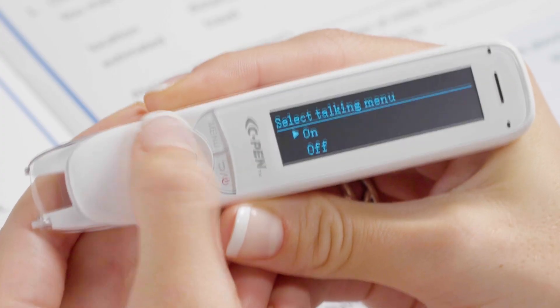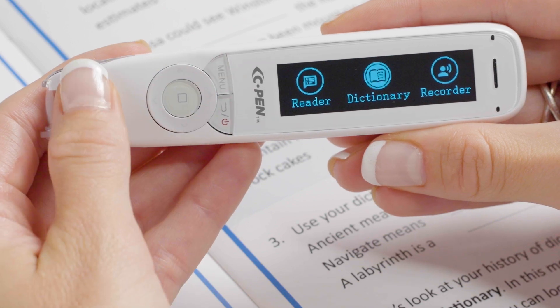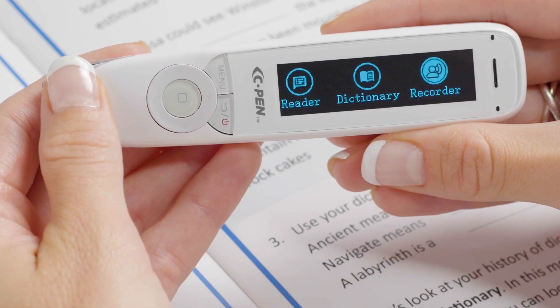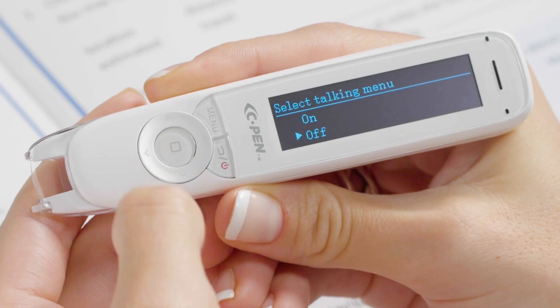The talking menu can be a useful feature for visually impaired users. However, for most users the talking menu can become a distraction, so we'd suggest turning the talking menu off.